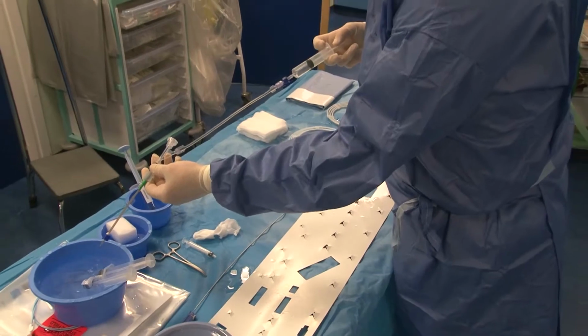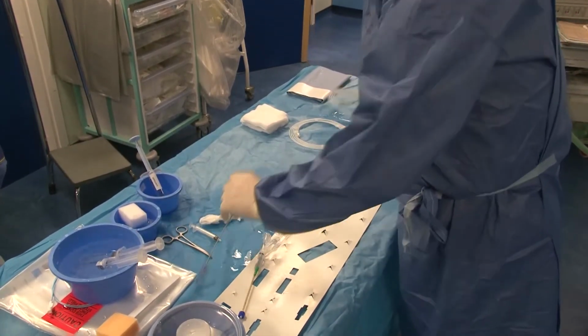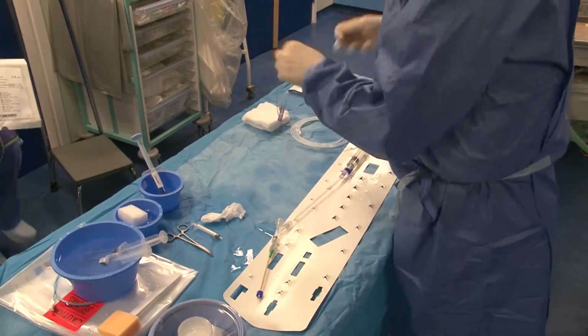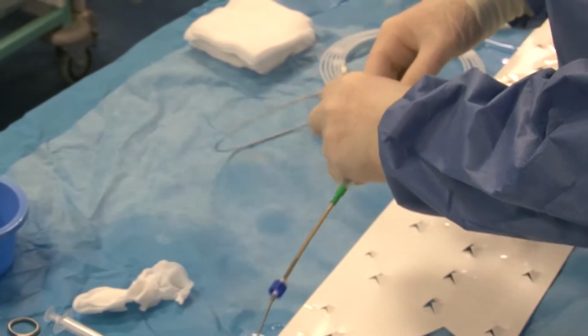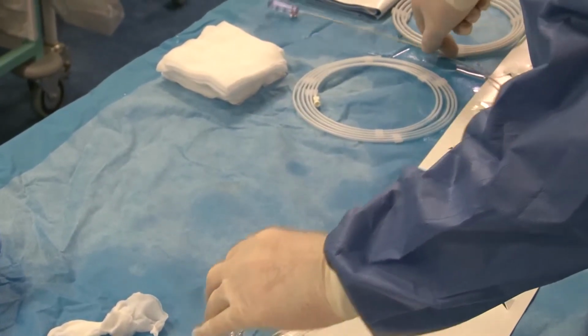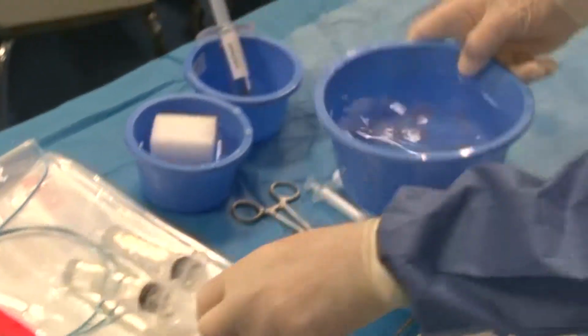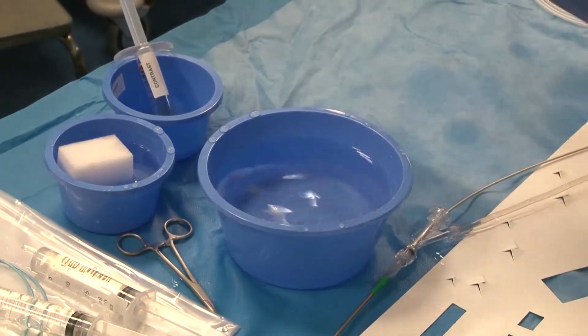We make sure they're all secure, and then flush the system, and then we'll pass the delivery cable through here, so that's ready to go. And Pam has a 25mm occluder device. Thank you.